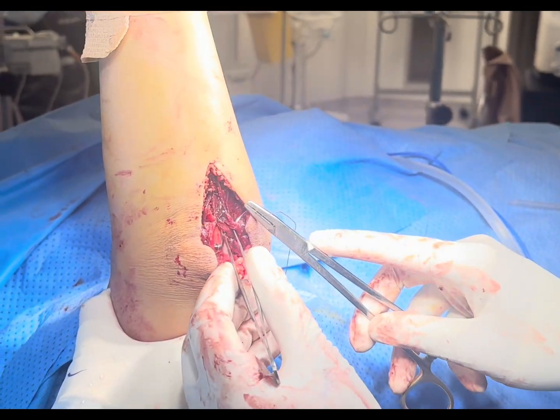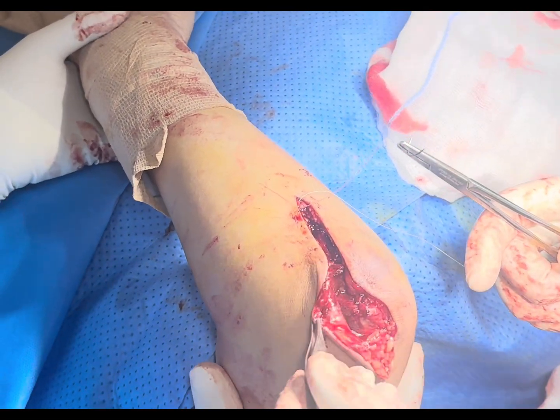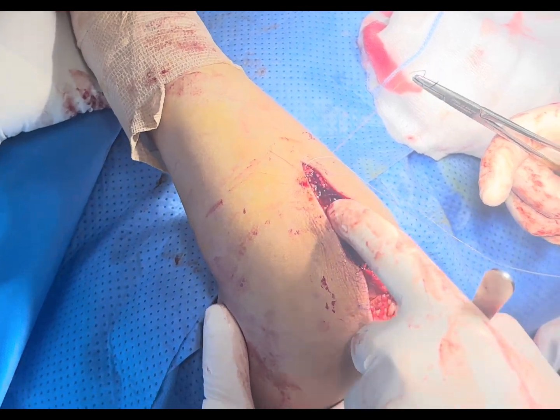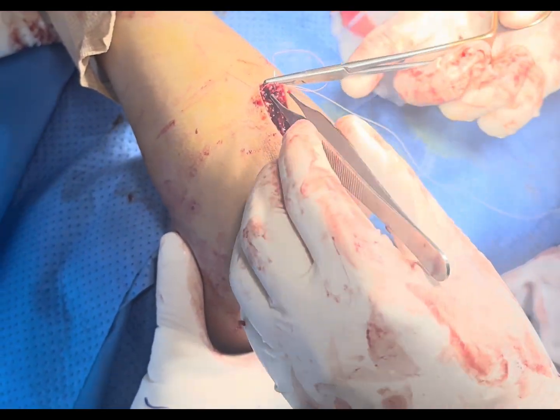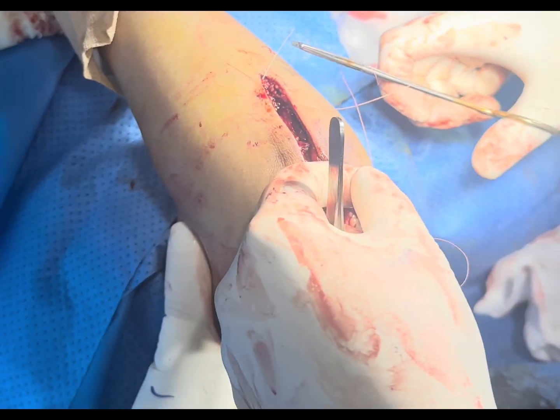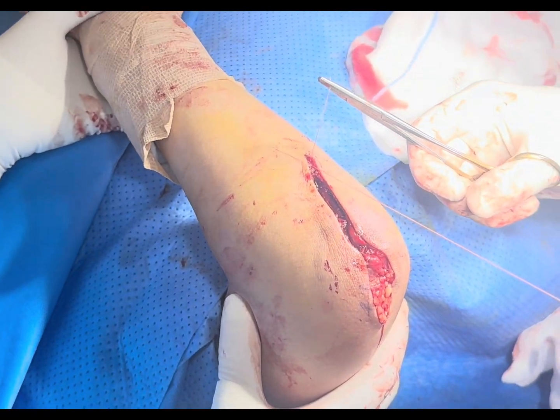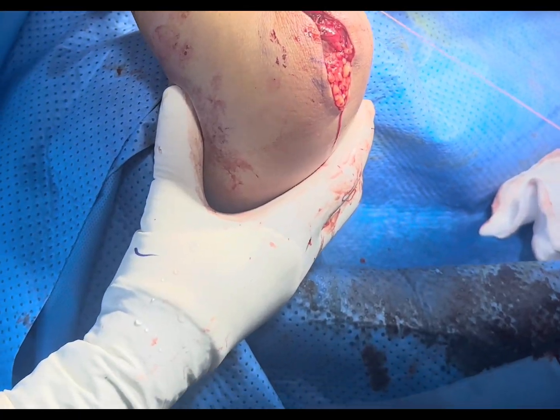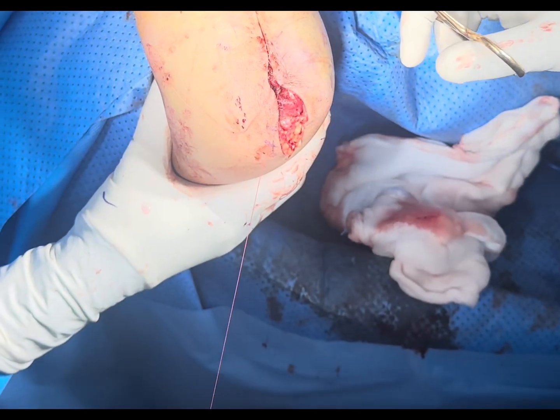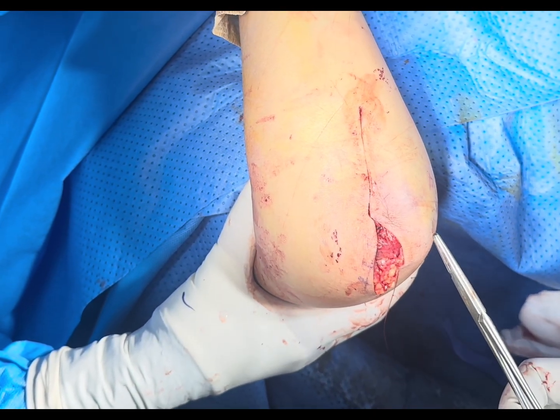Let me put a couple of stitches and then we will see you back. We have closed the muscles — you can see there are no wires visible, it is fully covered by the muscles, so there will be no pressure on the skin. Now I am going to put the self-absorbable stitches, so in the future the patient will not need to have stitches removed. We are putting cosmetic stitches here. After the remaining stitches we will do the dressing, and we start mobilizing the patient immediately.